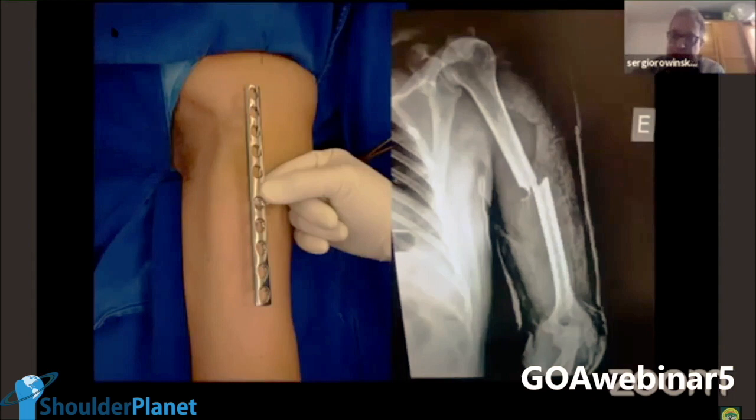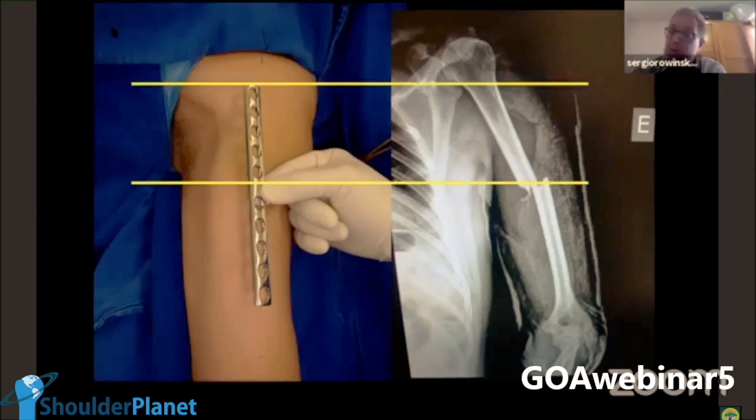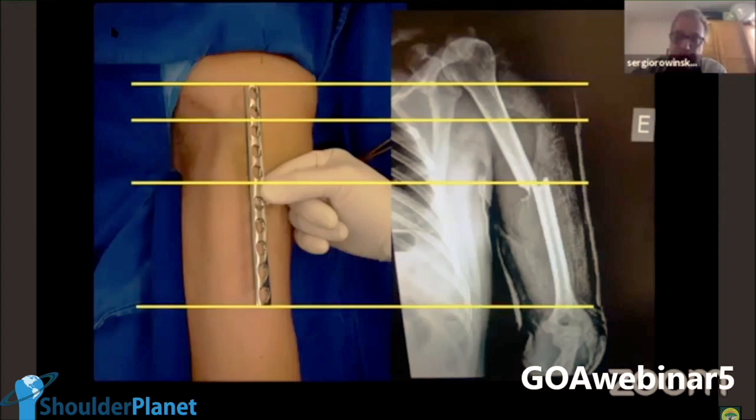So what do I do? When it's a mid-shaft, I can put the middle of the plate in the focus. I pick a marking pen, and I mark on the skin the upper part of the plate and the interval between the second and the third screw, and the same thing inferiorly, the inferior part of the plate and the second to the third screw from down to up.